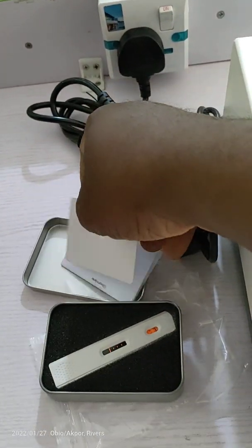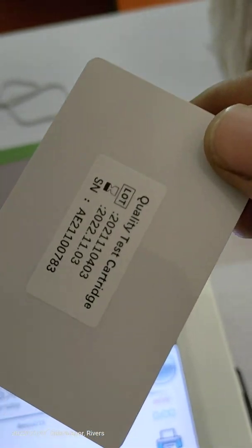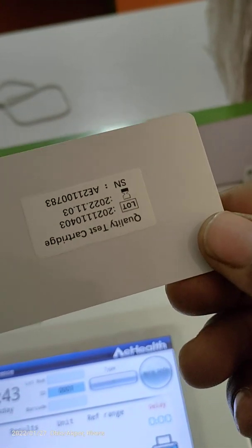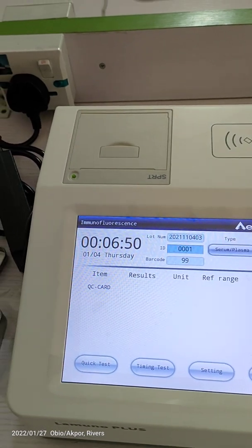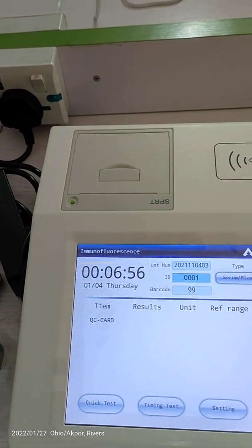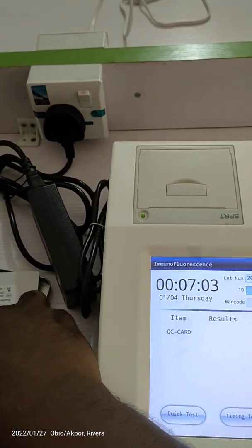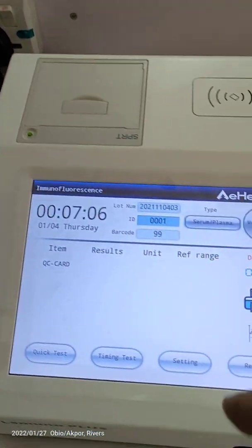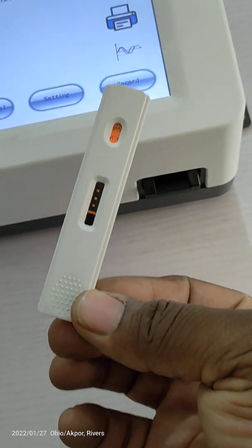This is the QC card — the ID card for the QC. Each reagent has its own ID card, and it communicates with the machine. When the reagents have their own ID card, that ID card is also registered. When you swipe it here, it's already showing 'ID card — QC card.' So once you swipe it, it will detect what it's for and the machine is ready to read the QC cassettes.